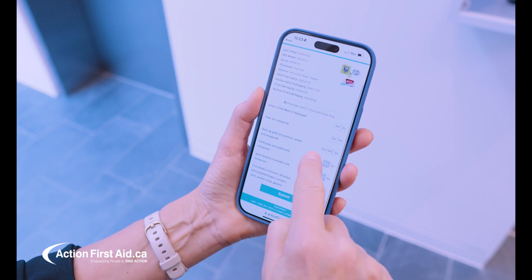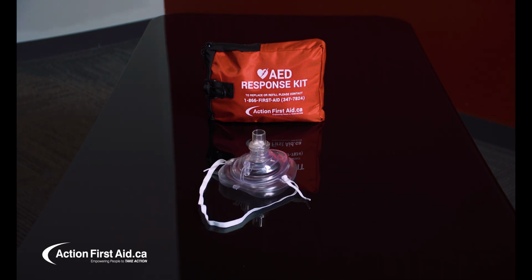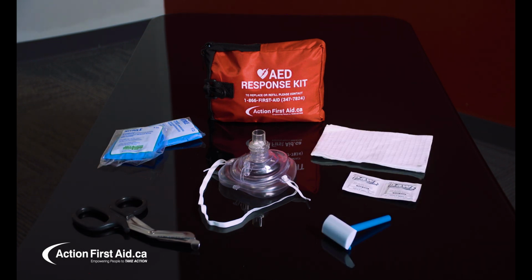ready to be replaced. Let's confirm the AED's first aid kit is present and complete. Your AED first aid kit should contain one-way mask, gloves, scissors, a razor, an antiseptic wipe, and a towelette. Please note some of the contents have expiry dates as well.